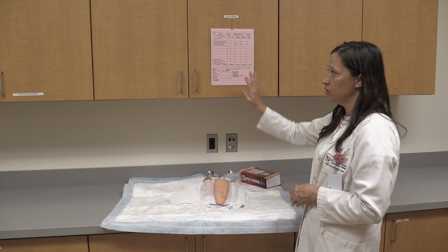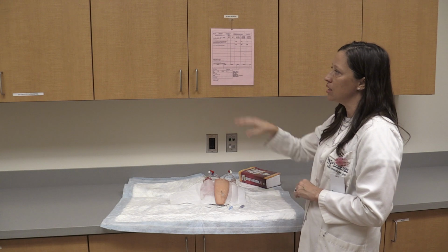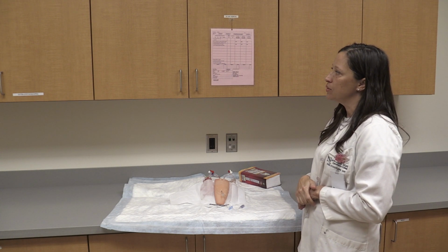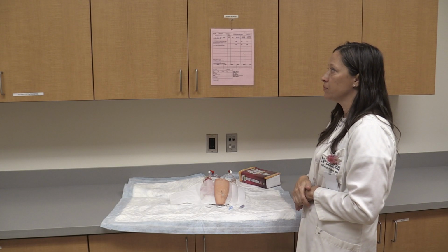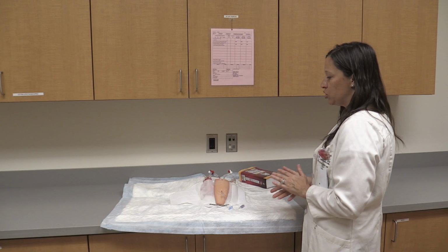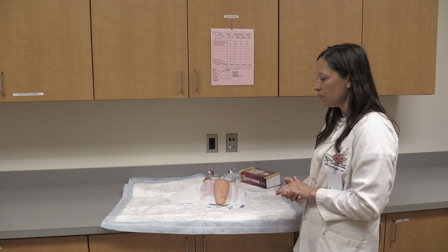First thing I'm going to do is look at the MAR to see if indeed they can have some, because the MAR says that they can have morphine, 2 milligrams, IV push every 4 hours, PRN, severe pain. So it has indeed been past 4 hours. So I'm going to do a pain assessment using the PQRSTU.